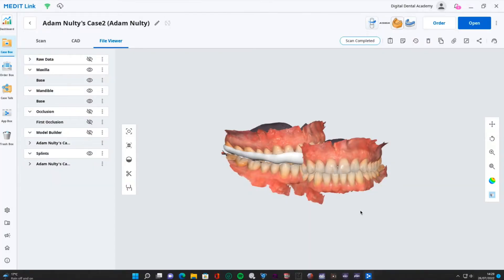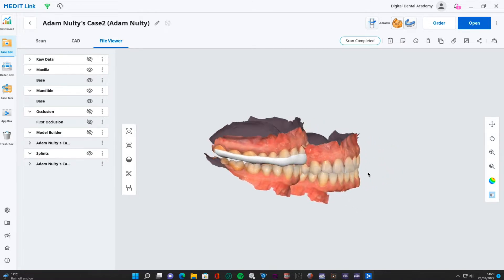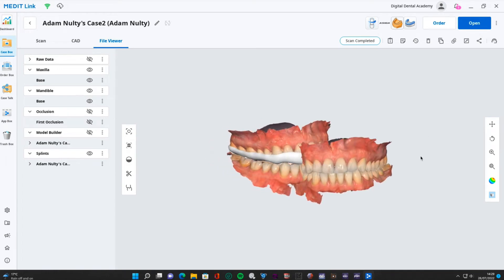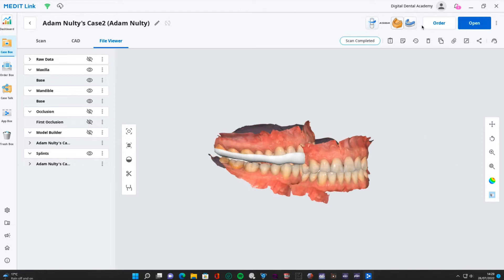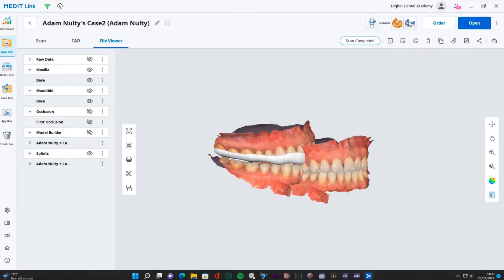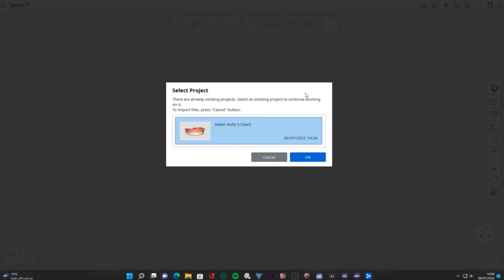In the last tutorial we looked at the AI generation using the new Medit splint app. In this tutorial we're going to look at it from a different perspective - we're not going to use the AI function, we're going to go through with a manual generation, going through each of these steps one by one to be able to customize it. Let's click on that little new blue icon for Medit splints.